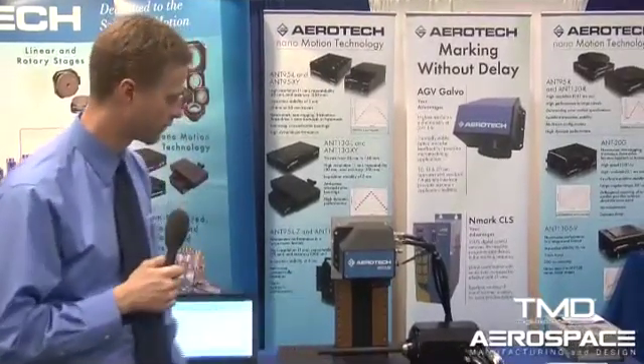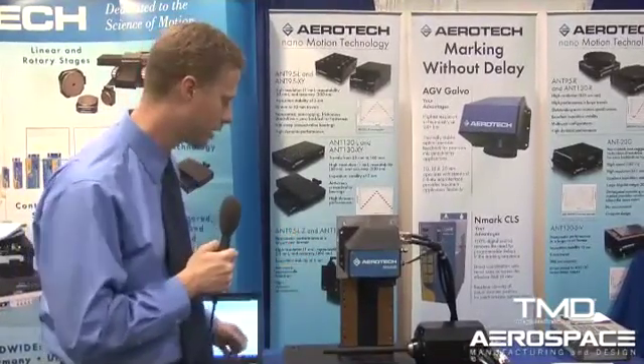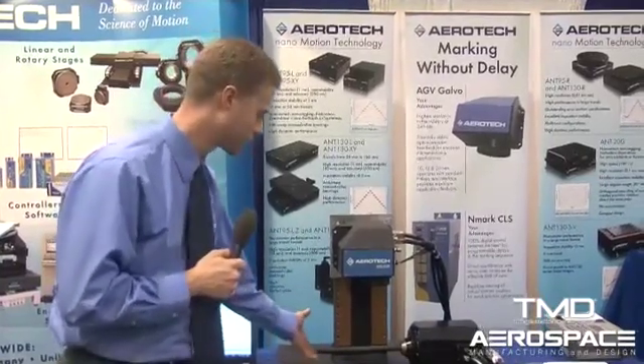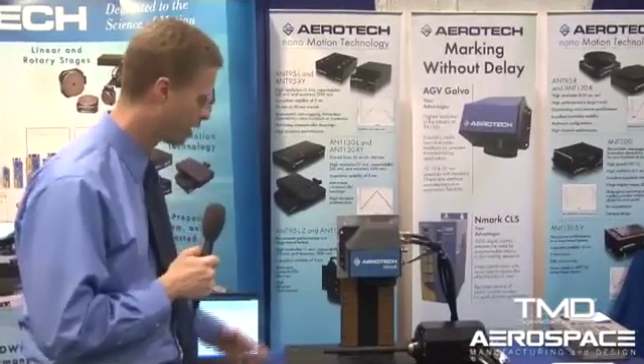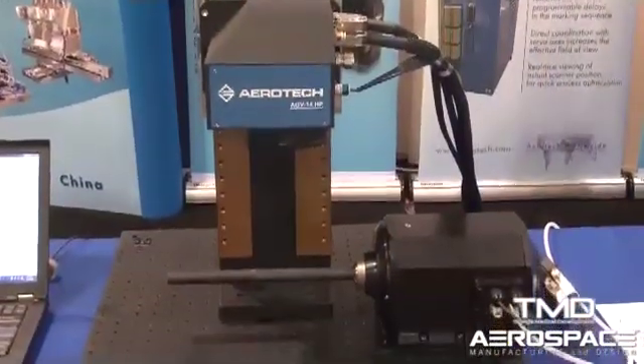We're using them in concert for this demonstration to show how such a combination of products would cut a cardiovascular stent. We've previously engraved into this aluminum tube a stent profile along with some other marketing information, and we are retracing the pattern using a laser diode, as you can see.